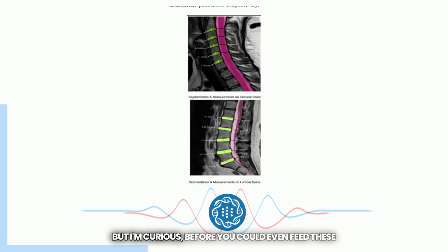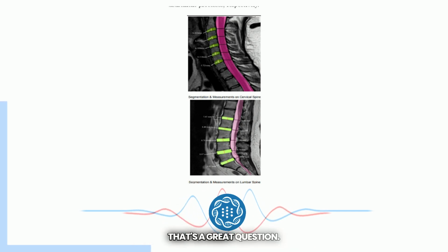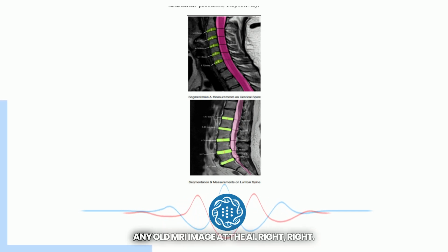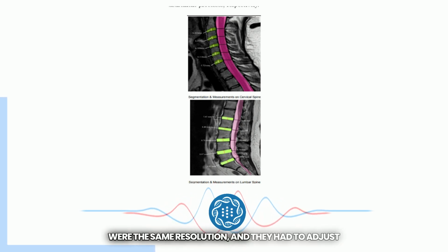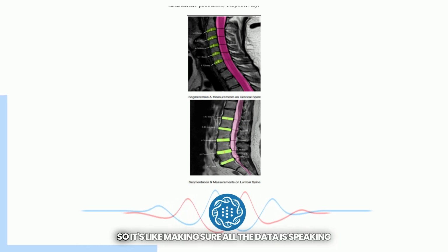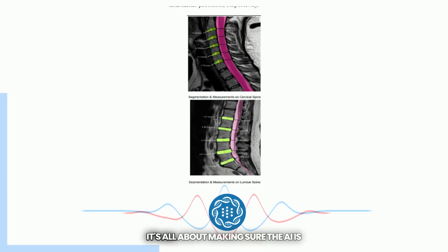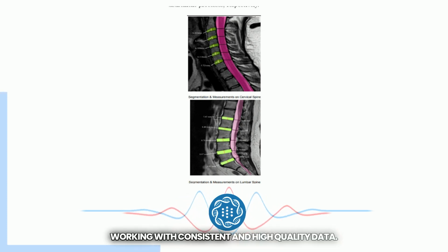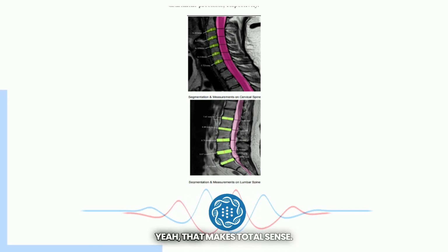That's pretty amazing. But I'm curious, before you could even feed these MRI images to the AI, is there any prep work that needs to be done? That's a great question. It's not just a matter of throwing any old MRI image at the AI. Right, they actually had to do some pre-processing. They had to make sure all the images were the same resolution, and they had to adjust for differences in contrast between different MRI machines. So it's like making sure all the data is speaking the same language before you give it to the AI, right? Exactly. It's all about making sure the AI is working with consistent and high quality data, and that ultimately affects how accurate it's going to be. Yeah, that makes total sense.